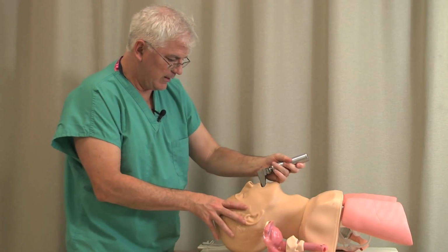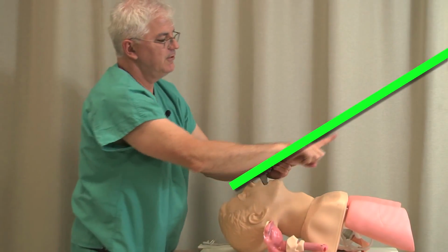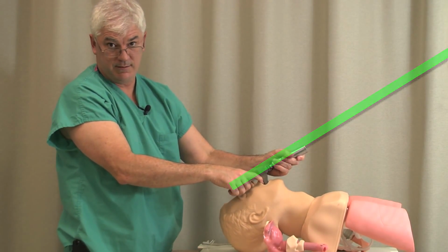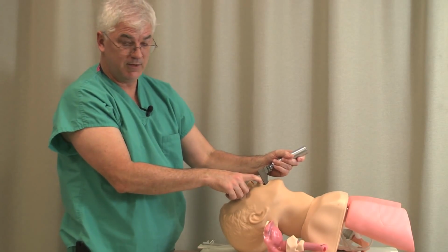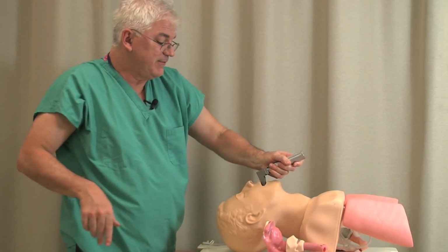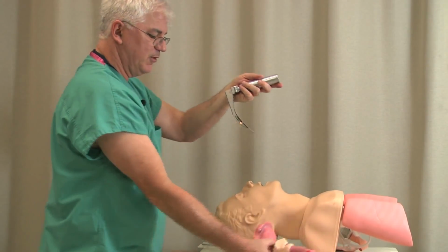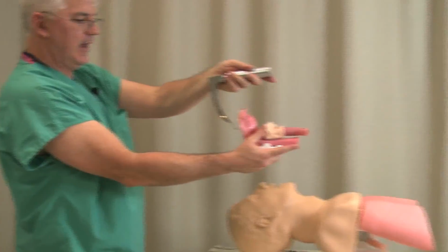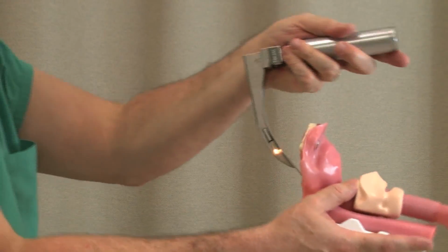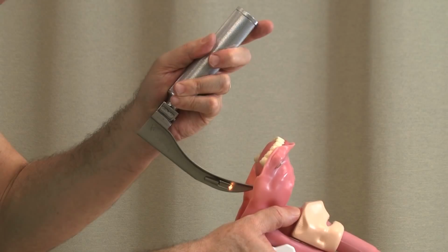You put it all the way to the right and then lift along the direction of the handle. Notice I'm lifting along the direction of the handle. This keeps me away from the upper teeth and affords me the best view. If I crank back, you hear that clicking sound? I'm clicking against the teeth. Plus, if I crank back, I'm actually cutting off my view. So let's say I have a pretty good view. Here's a little larynx here. I have a pretty good view, but if I crank back like that, you see how I've just blocked off my view? If I crank back, I've not only damaged the teeth, I've cut off my own view.